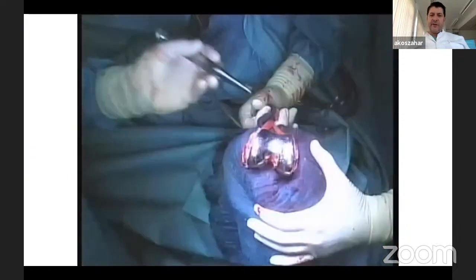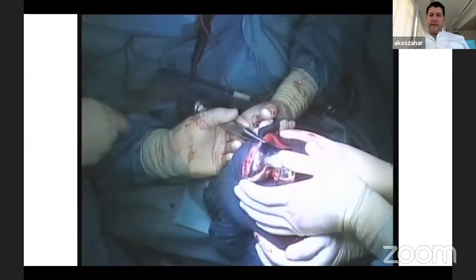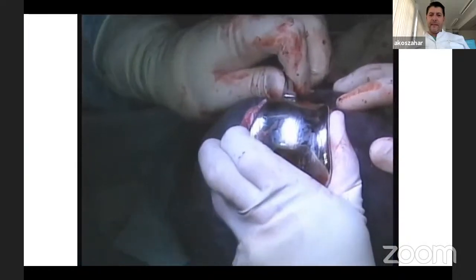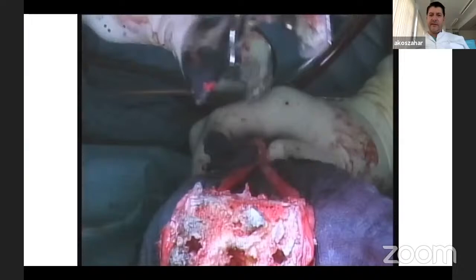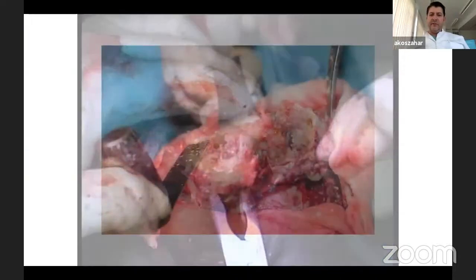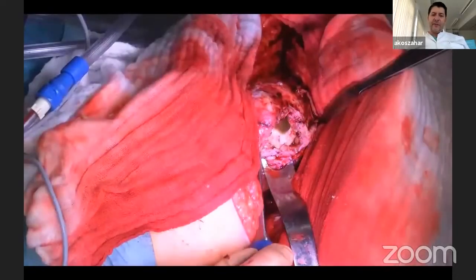Of course, you need special instruments, and then you can tap it out with this kind of device. Okay, now it's removed, and there you can see there is no bone loss. Then you can go for the debridement to remove the membrane, debride the bone with a power saw to freshen up the surface, to remove the membranes, to remove the bugs.